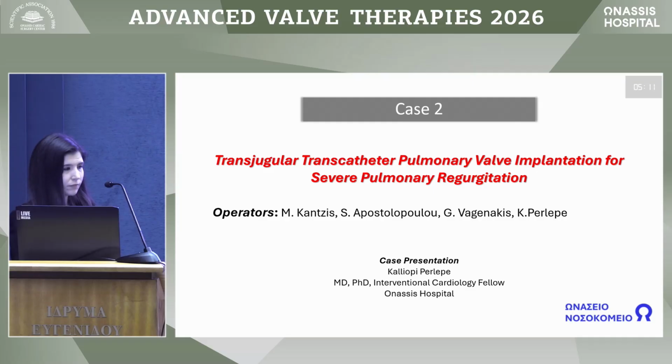We learn new things. So maybe the right heart space is more accommodating, more forgiving. I don't know if we could do that in the aortic area. I fully understand that, because in the aortic position you unfortunately have calcification around the coronary arteries, and that's why you don't know how the balloons will sit and in which direction they will break.